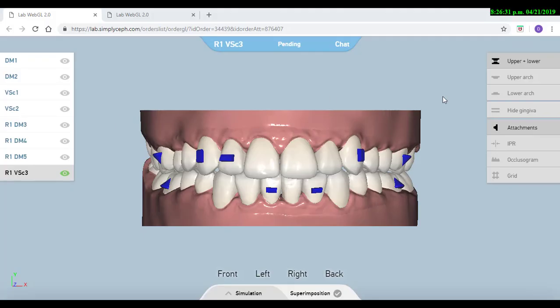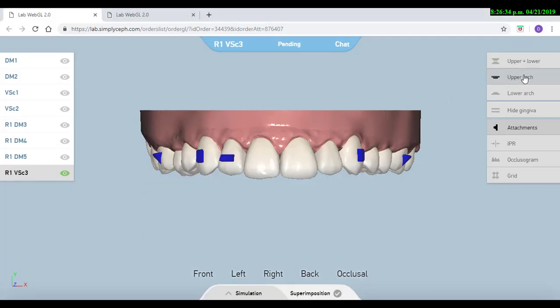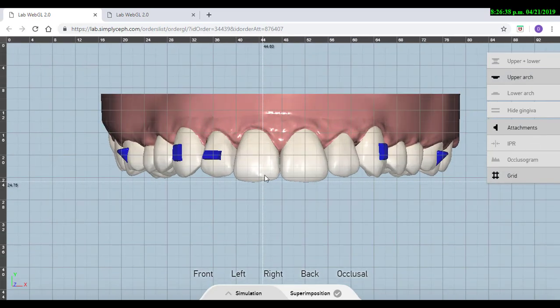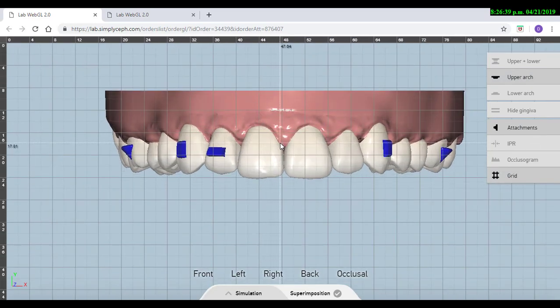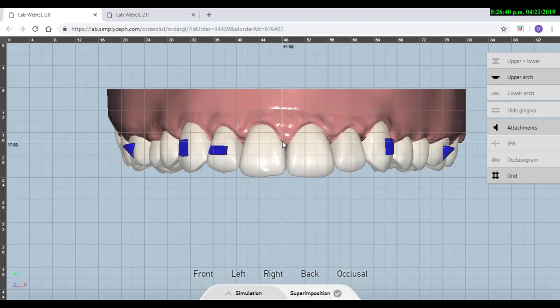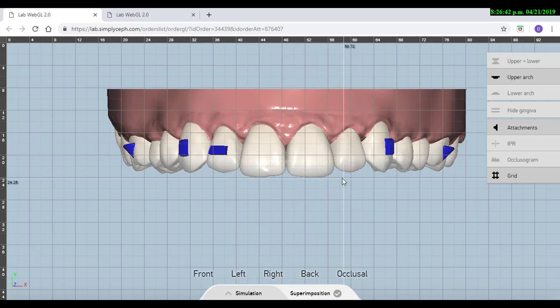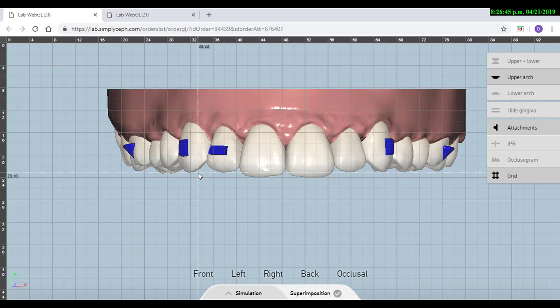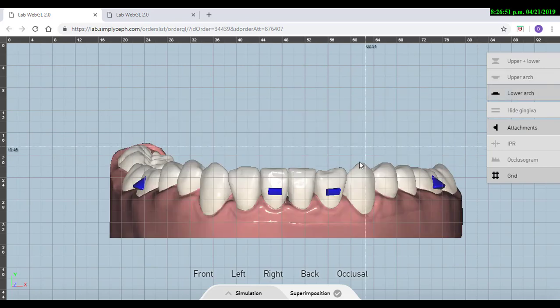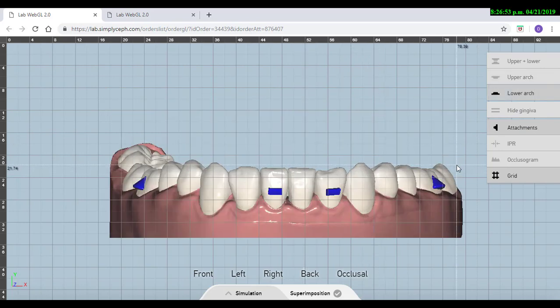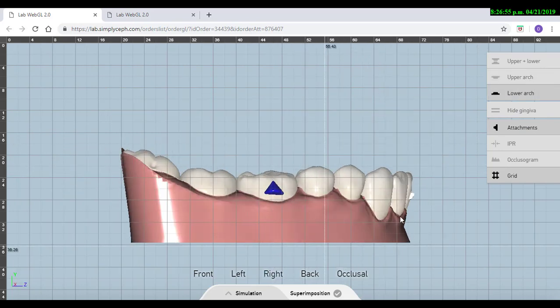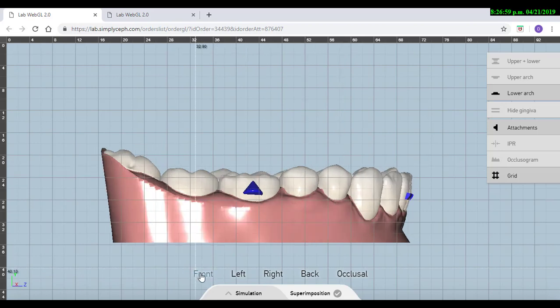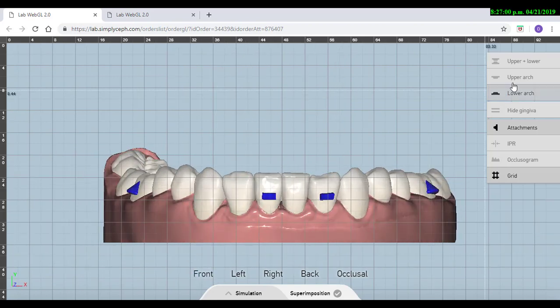We go and we select the arch that we want to examine first, we select the grid, and in here we can see, for example, okay, centrals are at the same level, but maybe I will extrude more the canine, so that is some change that I'm going to ask in a comment. Or in here, in the lower arch, I want to see how is that curve of Spee. I can see it from the front and also from the side, so that is something else that I want to check.